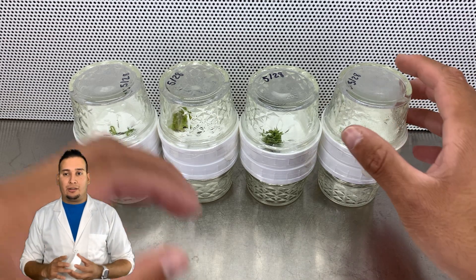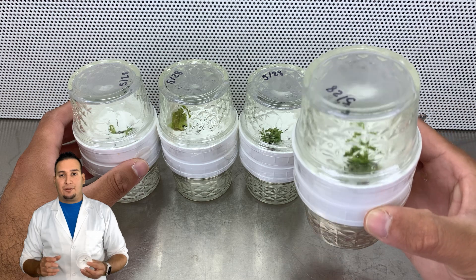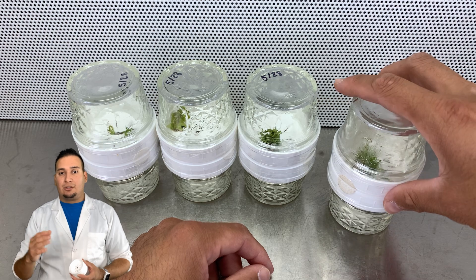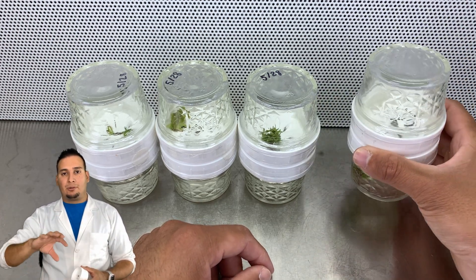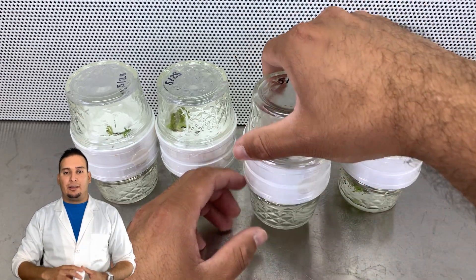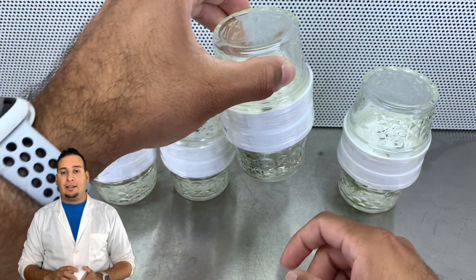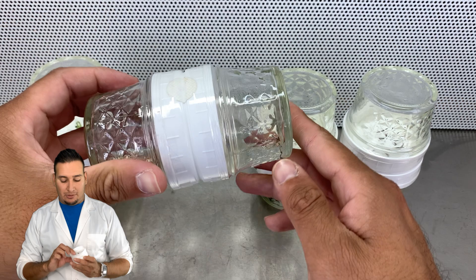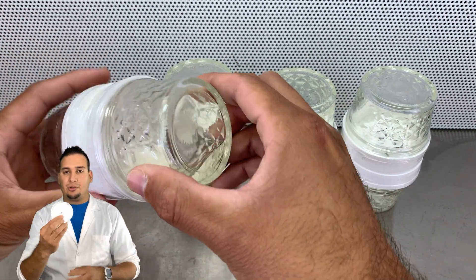After that I sealed the jars using parafilm, saran wrap, or you can even use electrical tape. This is basically a day after — I was moving the BioCouplers to the side. As you can see on this second one, there is media still on top.